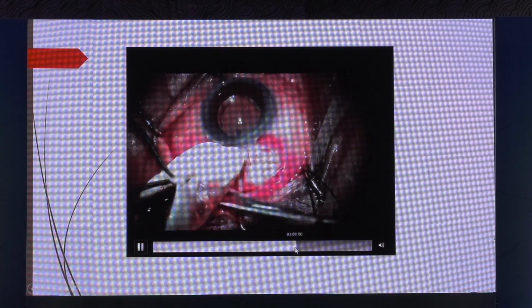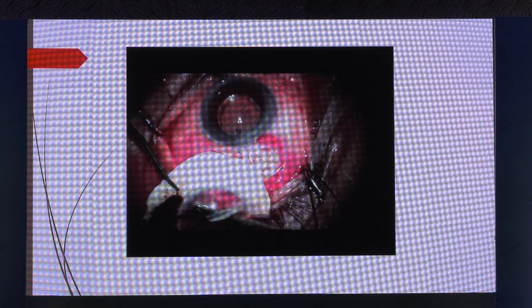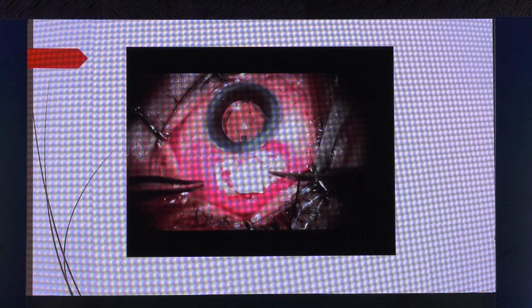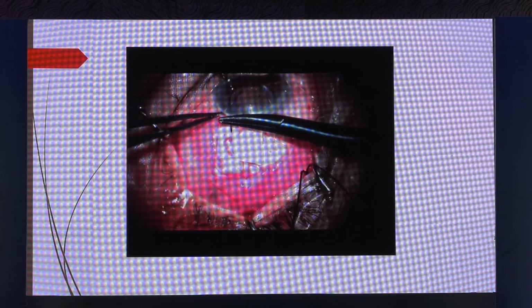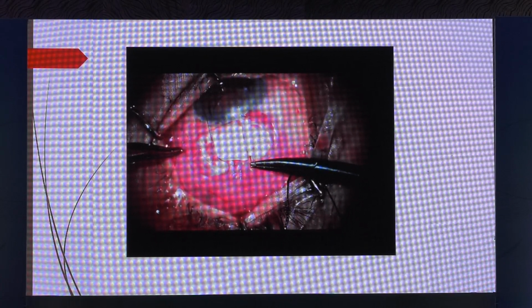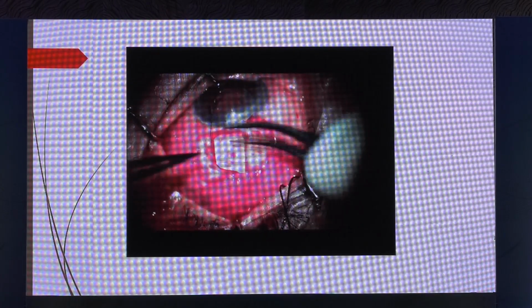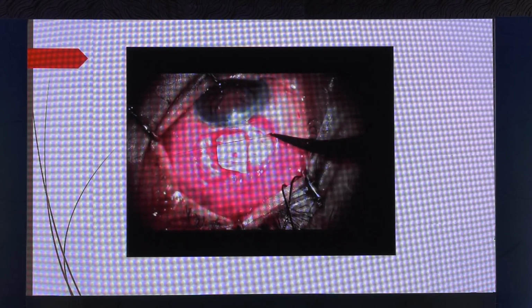And then there's the scleral patch graft. You can get this from the corneoscleral rim, which is available in our eye bank. So you can either take a sclera or a cornea or a part of sclera and cornea, whatever you feel. Again, with the box suture, you just cover the tube with the patch graft. And it's very, very important to cover the tube in its anterior part so as to prevent the extrusion.